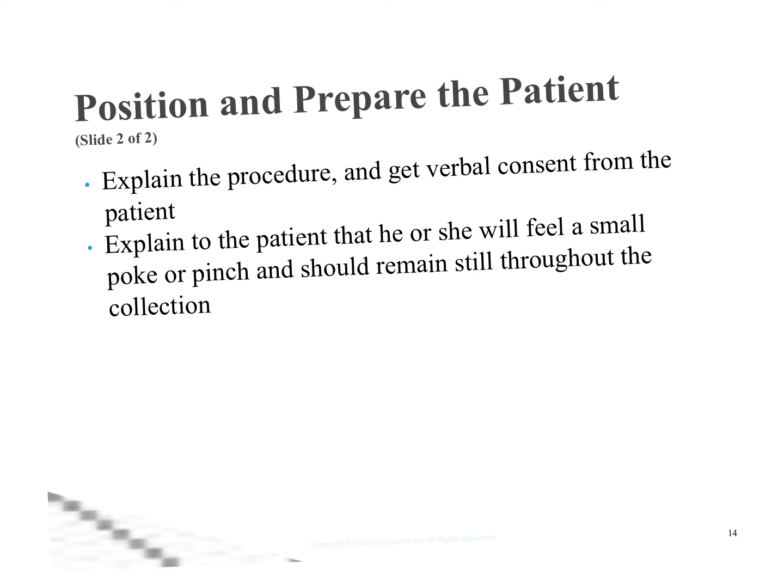Sometimes we do things in healthcare where we think, everybody knows what this is, we don't need to explain it. We still need to explain it to the patient. We still need to get their verbal consent.